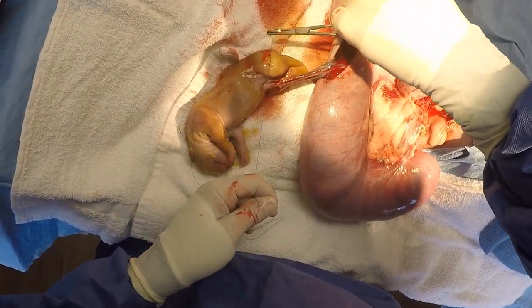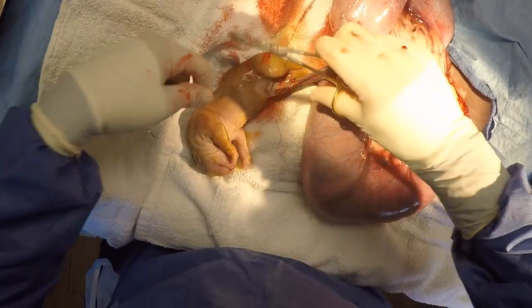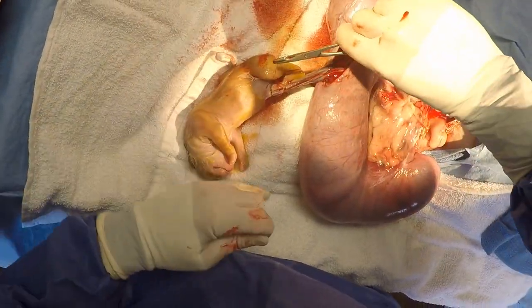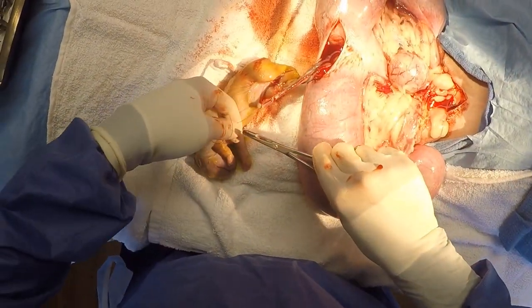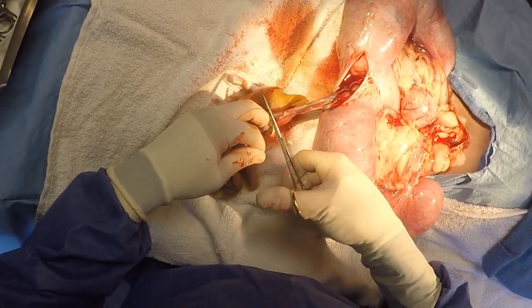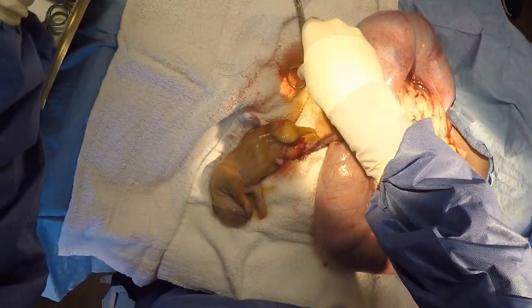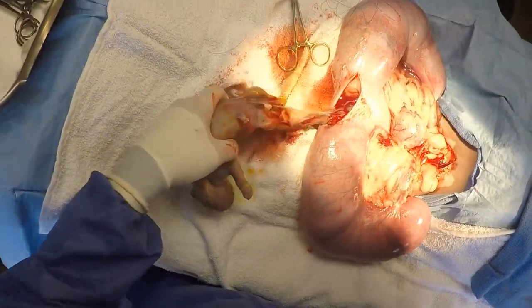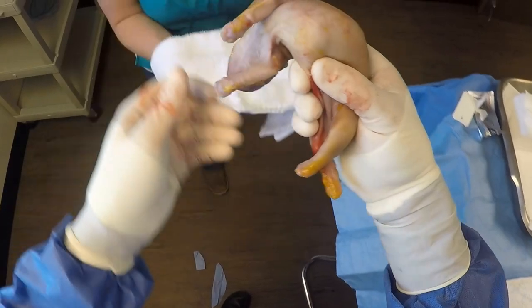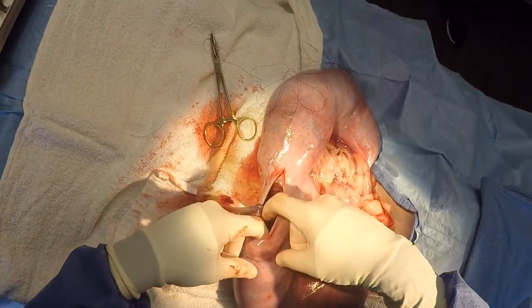Once the puppy is out, we will take and tie off the umbilical cord. Once the umbilical cord is tied off, it will be cut. The puppy appears motionless right now because it's sleepy — the anesthetic agent used to sedate the mother also gets into the bloodstream. The puppy is passed off to a technician who will stimulate it and get it revived.